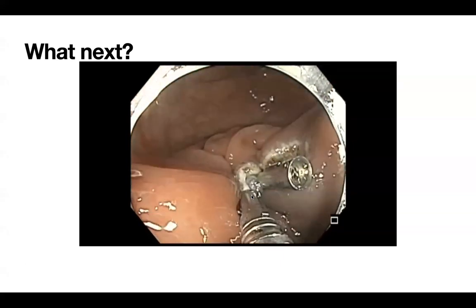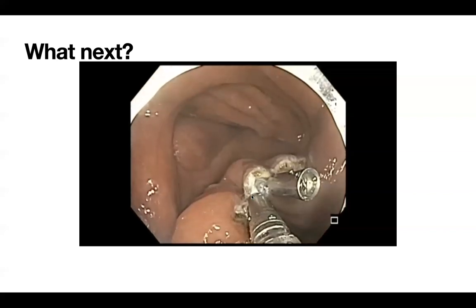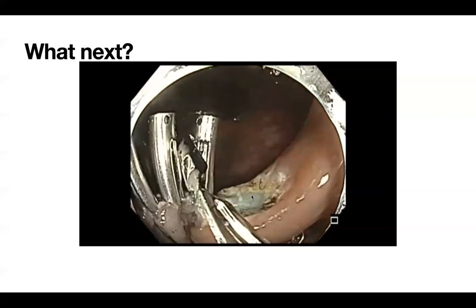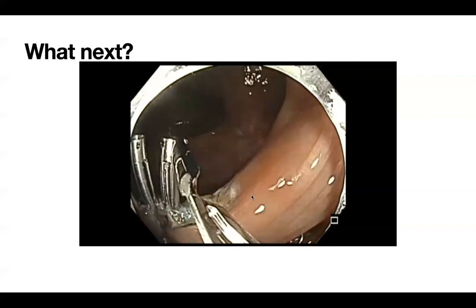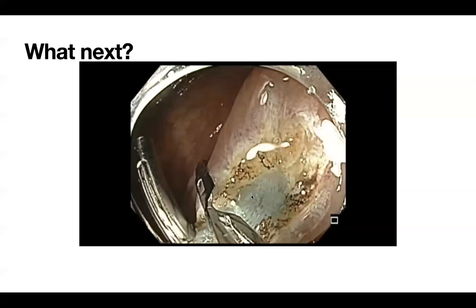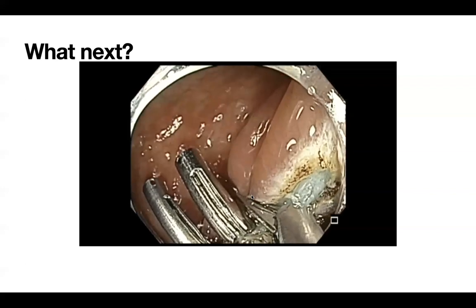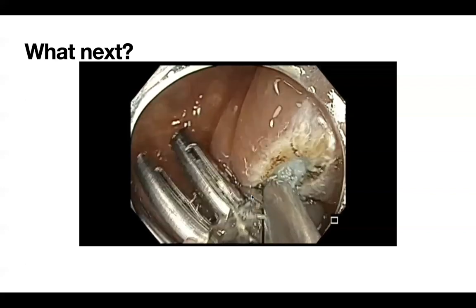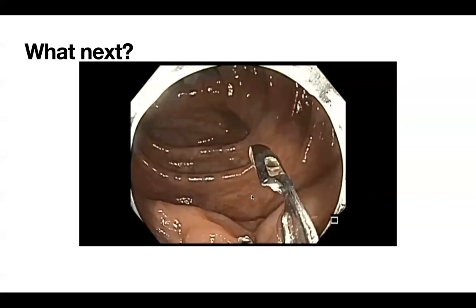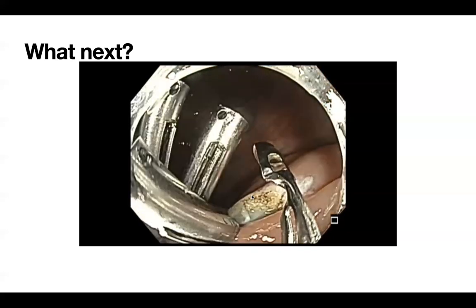And whenever you see any small island around that resection base, it is best to take it out during the same resection, so that down the road, when you're examining, the scar tends to pull that adjacent island into the scar tissue and make you feel that you actually had a recurrence, which was not a recurrence, but a polyp that was sitting by the side of the original polyp. So something to keep in mind: clear off any polyp that you see at the edge of the resection.